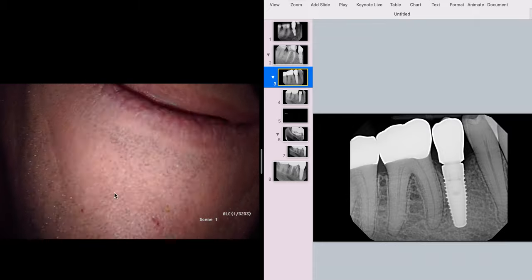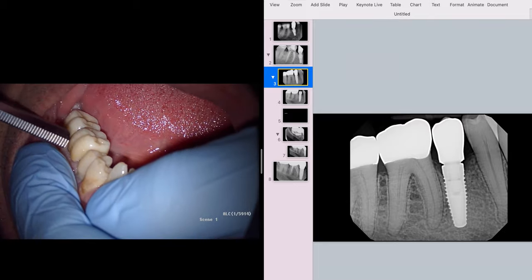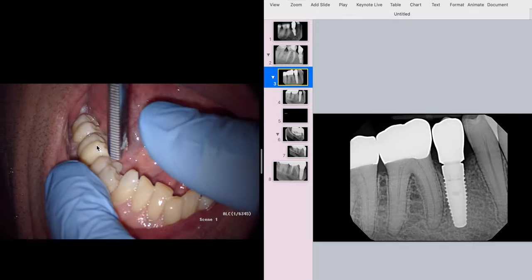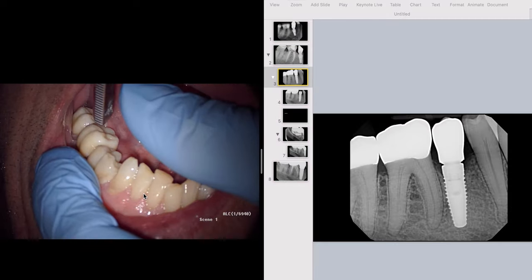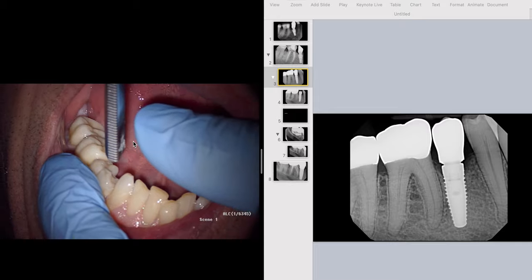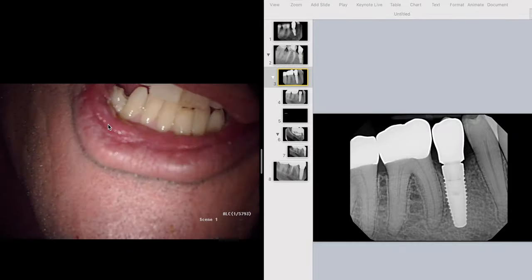This tooth is still vital based on his symptoms — we'll confirm that in a moment. Next, we're going to do some lateral percussion. My buddy Reagan told me to think about lateral percussion. I haven't found it in the literature, but he was symptomatic on lateral percussion on 4-6. I use my thumb as a guiding plane so the mirror handle doesn't slip off the cusp tips. He has pain on 4-6 and no pain on 4-7.